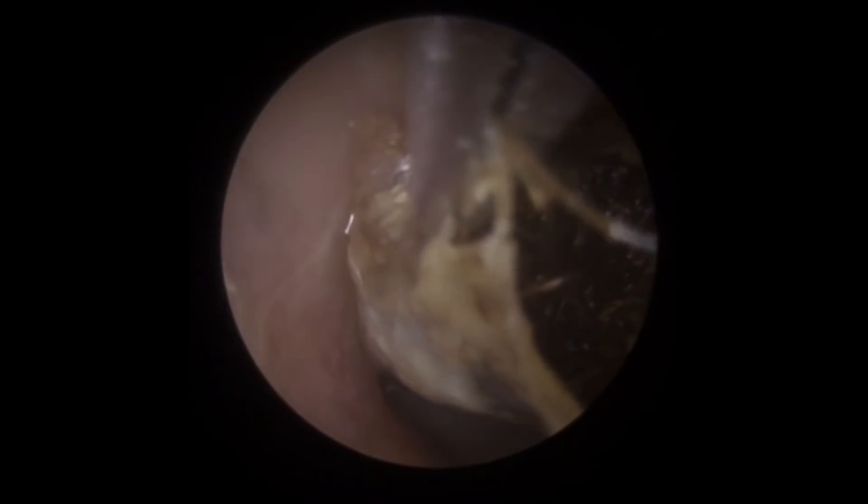We can get a grip on that section now. Just slowing this video down so you can see this coming away — it's a gentle steady pressure. We can see a glimpse of the eardrum there behind, so we know we've moved it away from the drum now. It means we can move it a little bit more to get this blockage just the remainder of the way out.